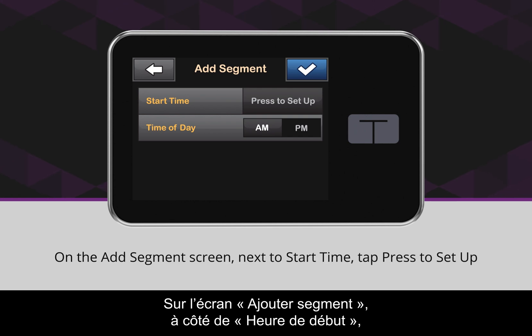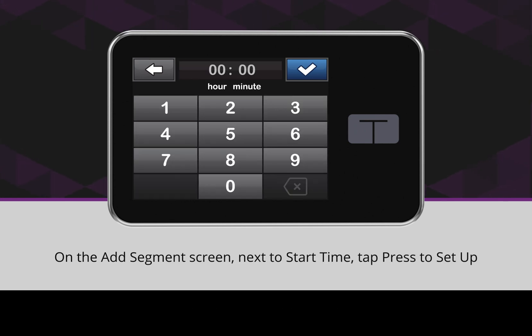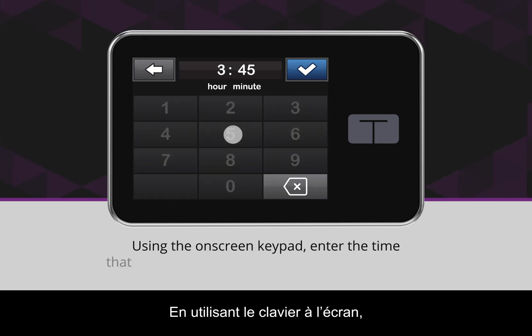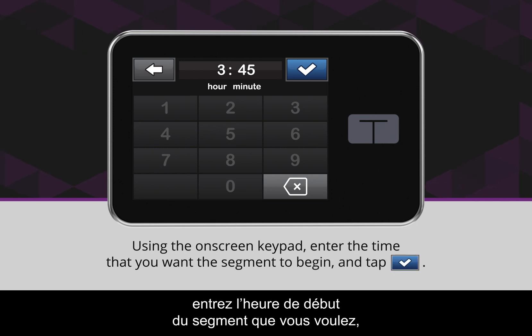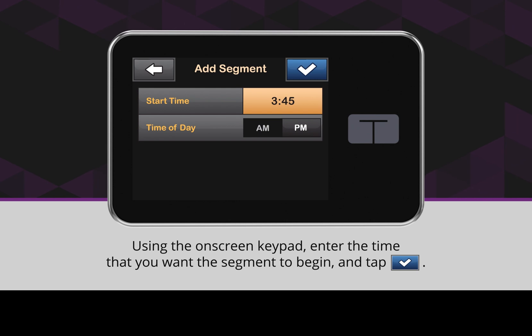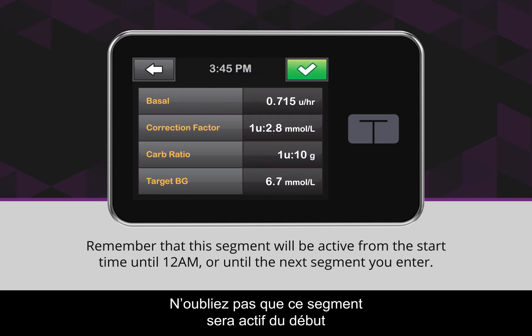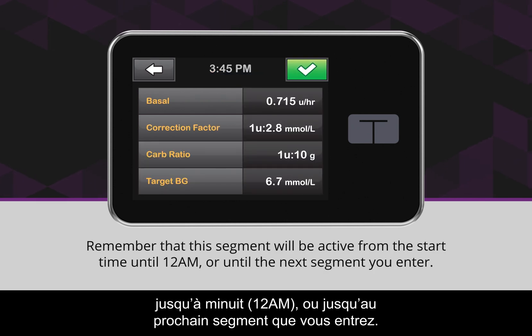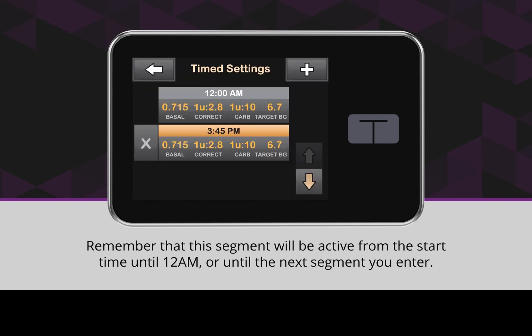On the Add Segment screen, next to Start Time, tap Press to Set Up. Using the on-screen keypad, enter the time that you want the segment to begin and tap the blue checkmark icon. Remember that this segment will be active from the start time until 12 AM or until the next segment you enter.